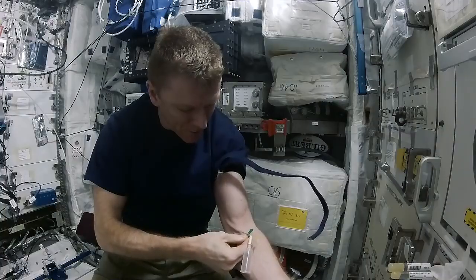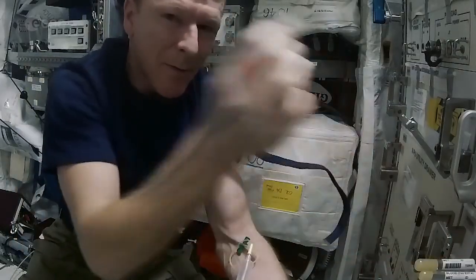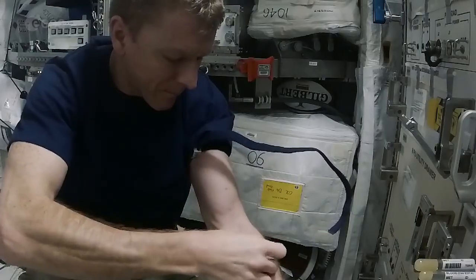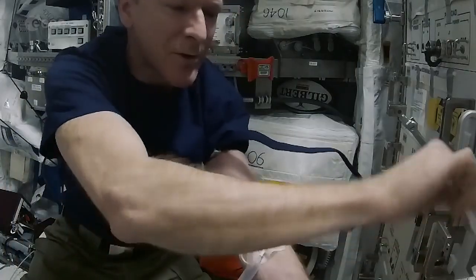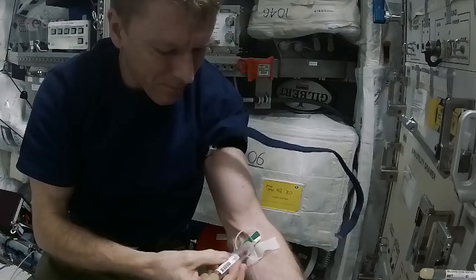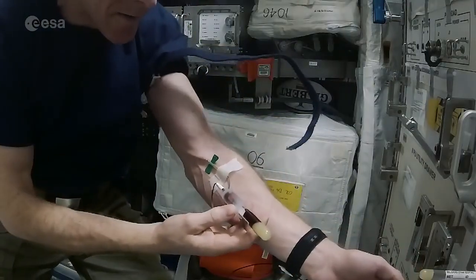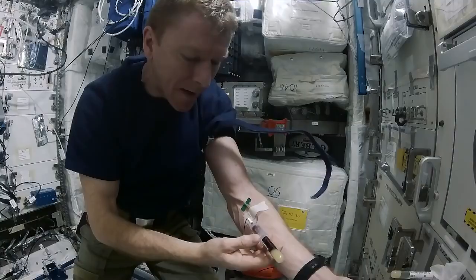In we go — wait till we get a flash. There's a flash there, so that's the needle in. I'm going to put a little bit of tape over just to keep that needle in the right position. That keeps the needle from moving around too much, and then the first tube I have to do is this one. The tube is filling up quite nicely — these tubes are vacuumed, so they'll be sucking the blood out.